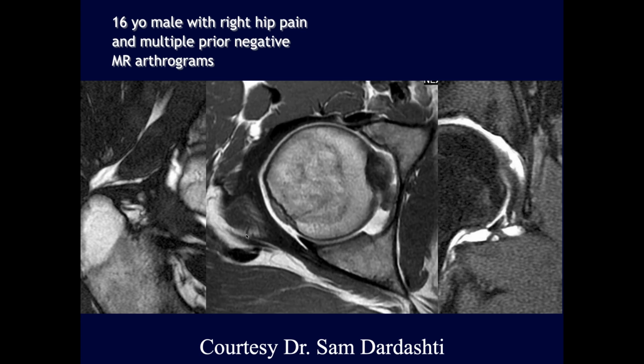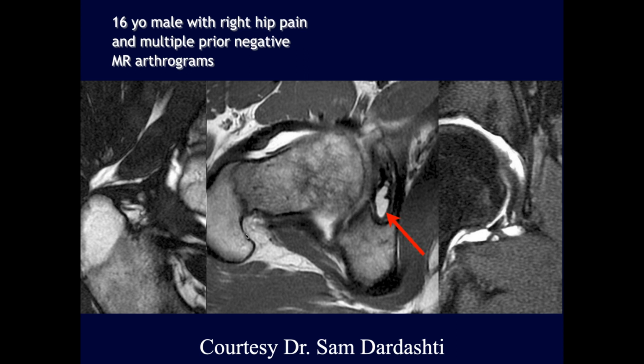And what is this? I assume it could just be a really thickened ligament that might just be tendinotic.